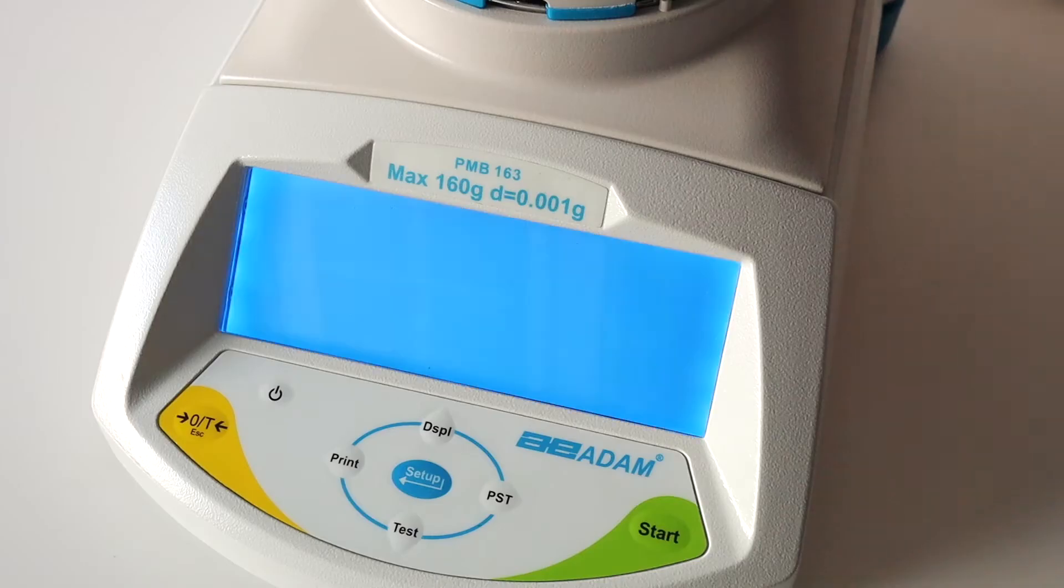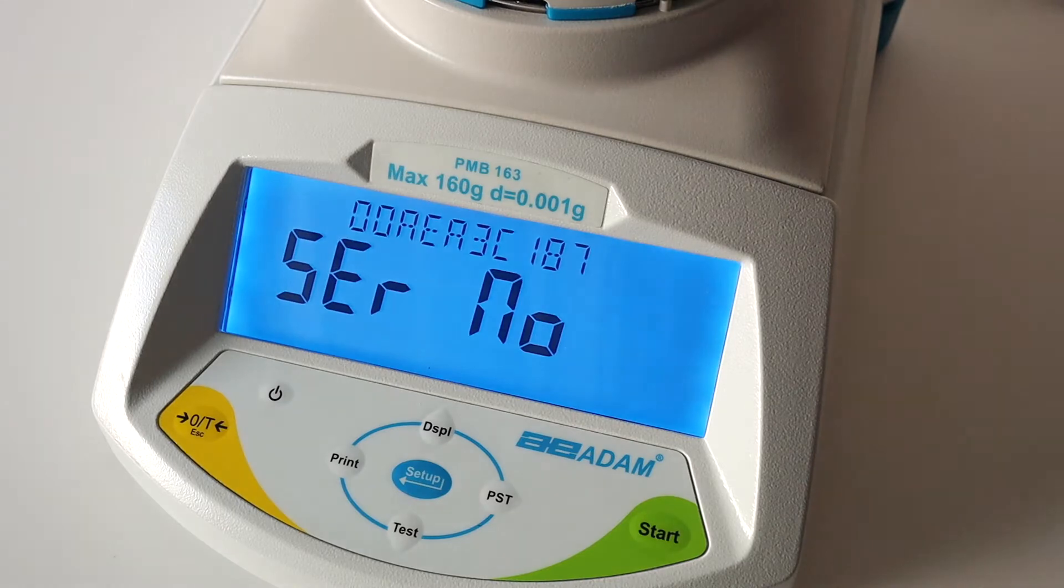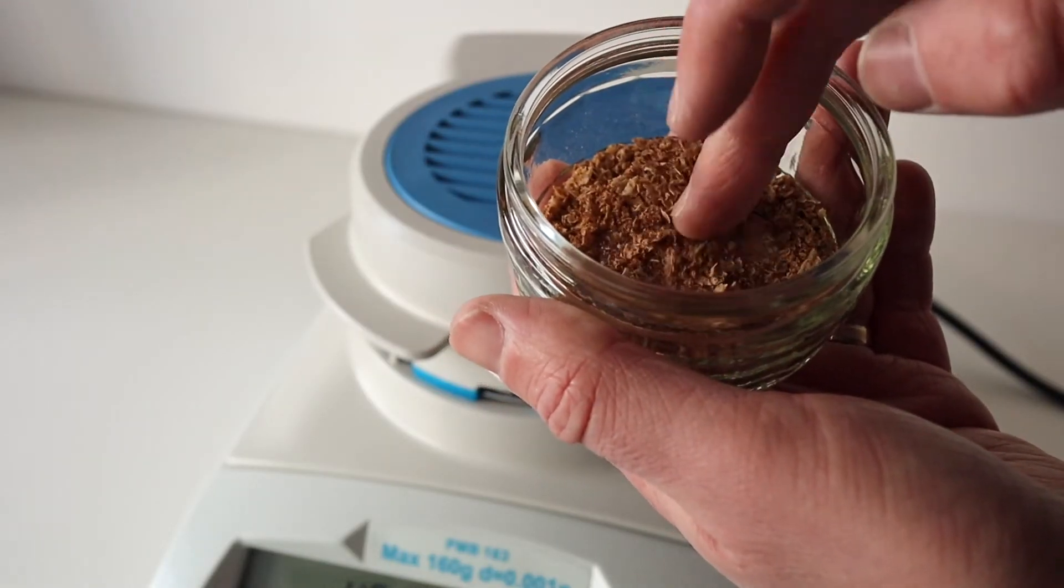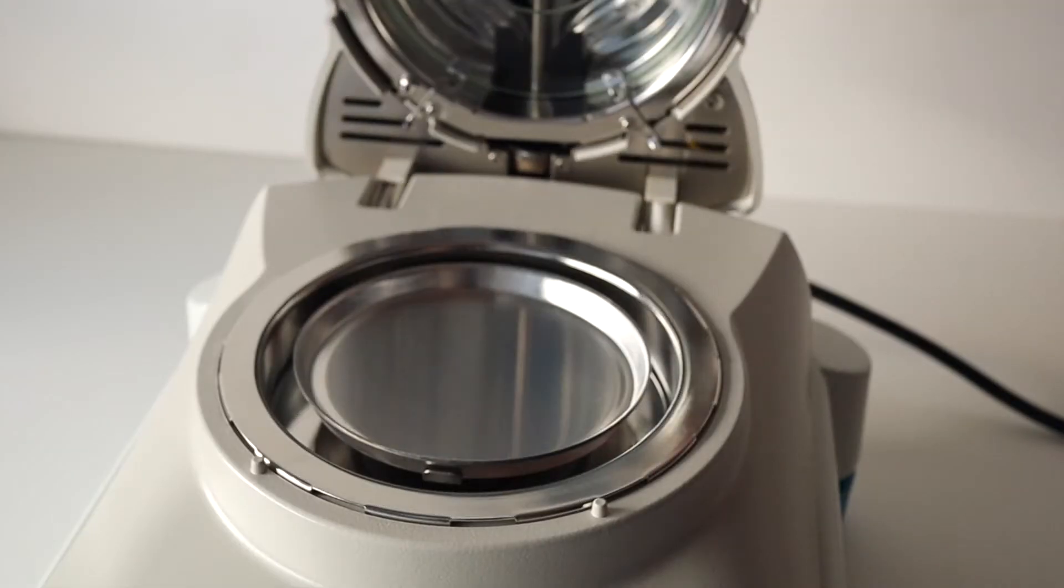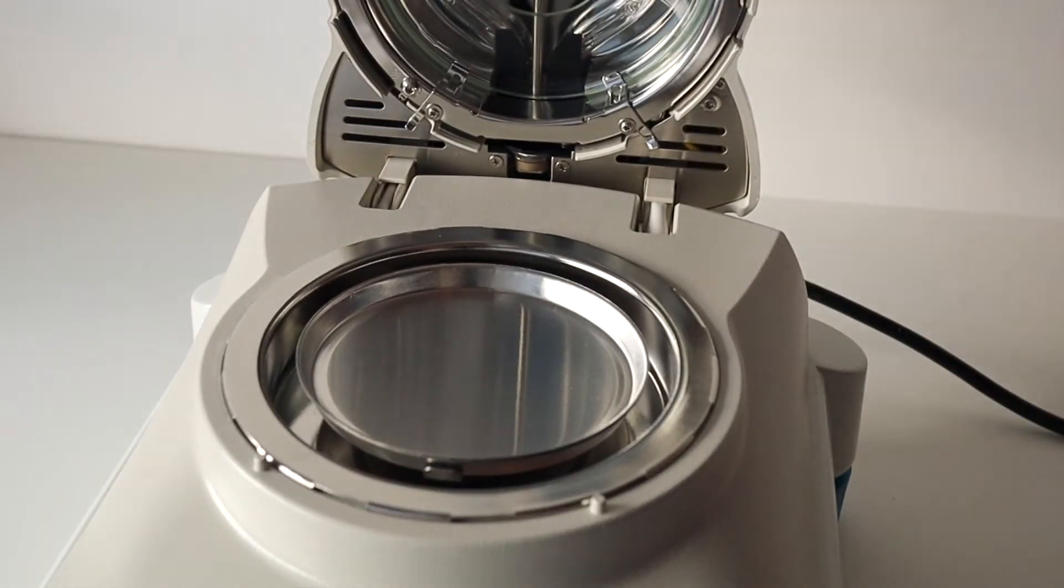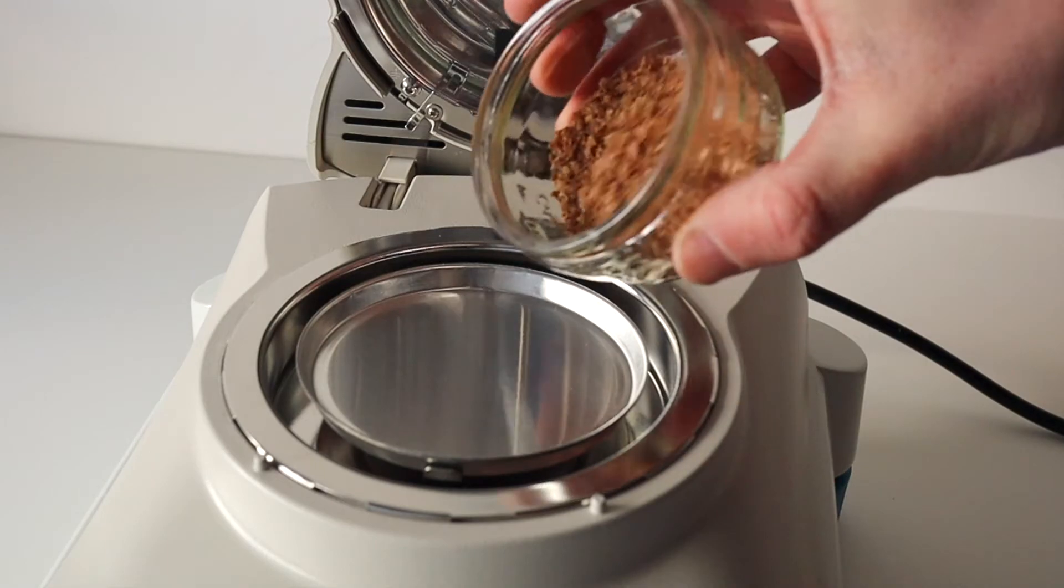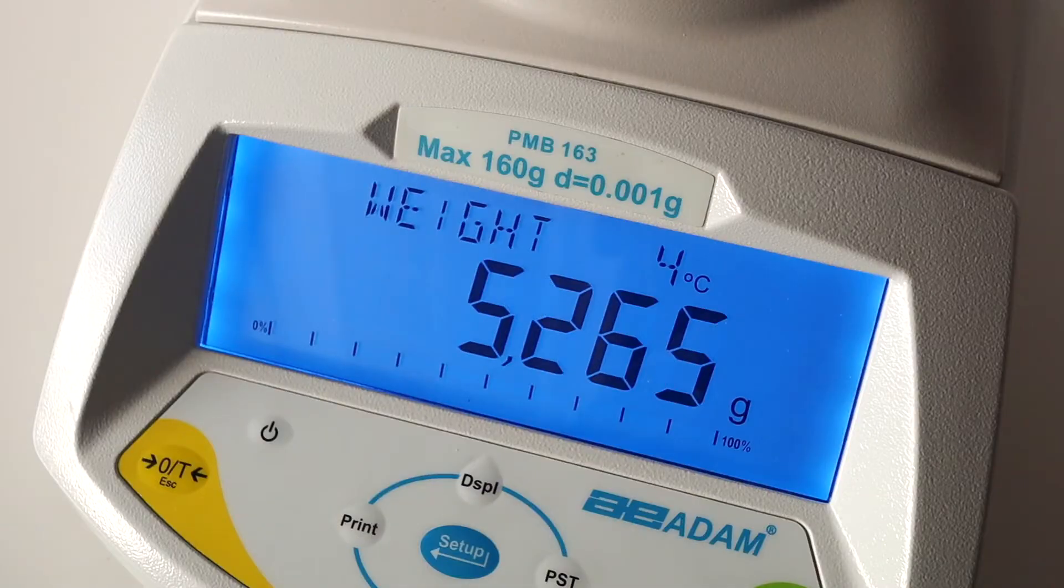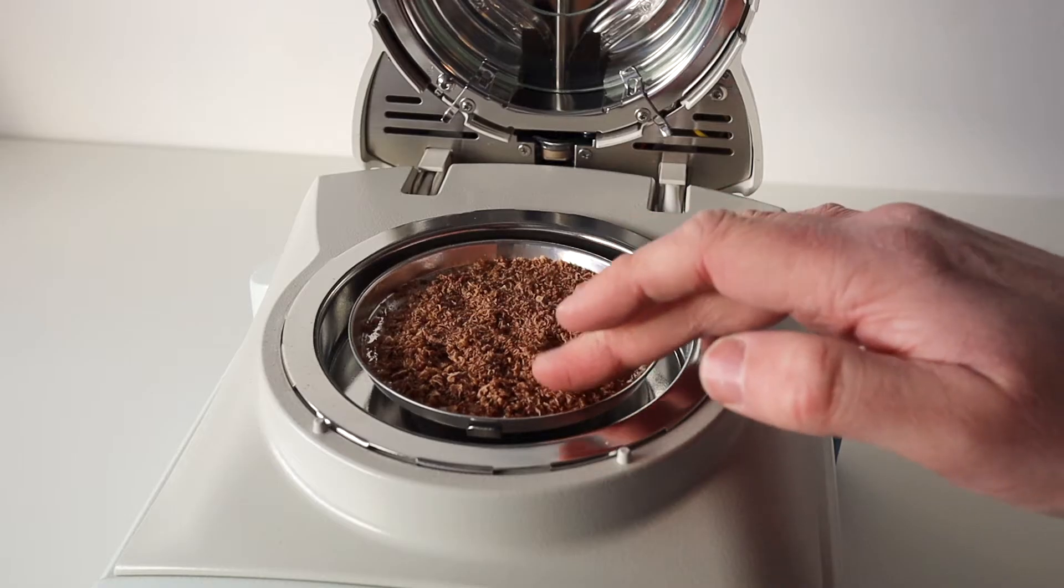Accurate sample preparation is essential to get the best results. Make sure the sample is finely crushed and add between 5 and 8 grams to the pan, evenly spread across the pan.